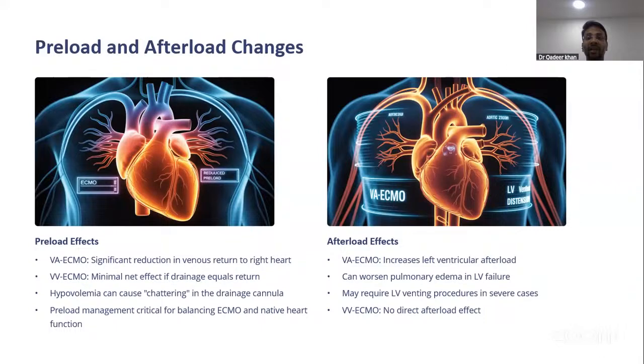Afterload in VV ECMO: there is no direct effect on the afterload. But in VA ECMO, it increases the left ventricular afterload. As I told you, you're giving the blood peripherally into the femoral artery, which can worsen your LV function and can cause pulmonary edema. In severe cases, the patient may require venting strategies.